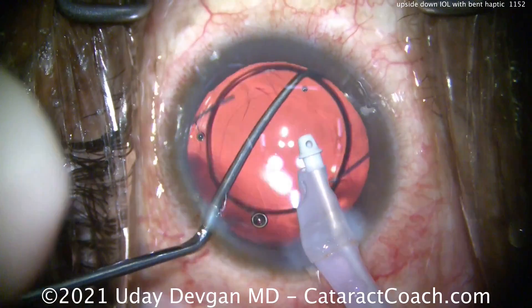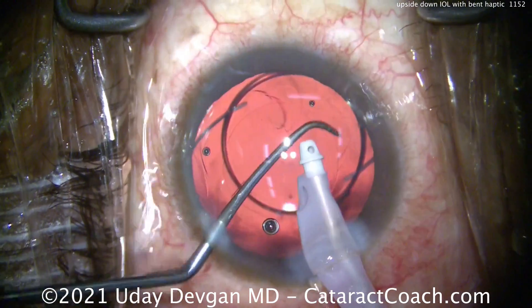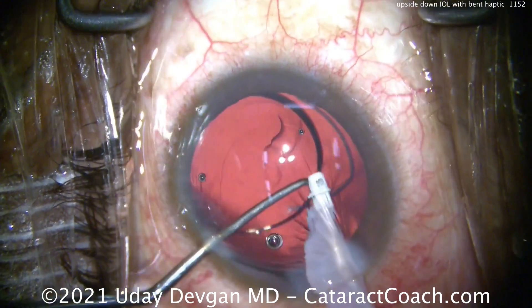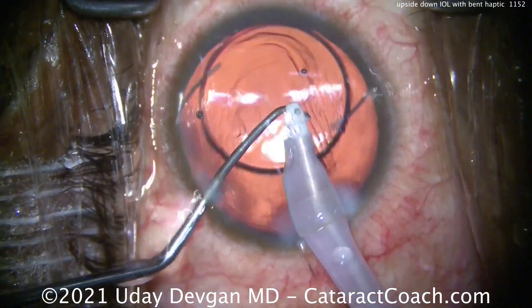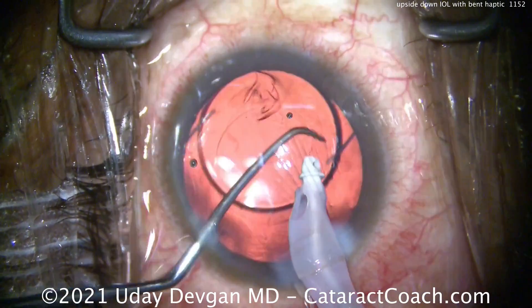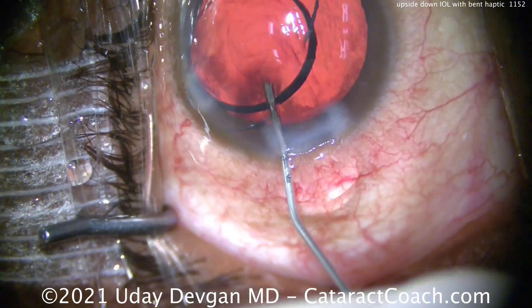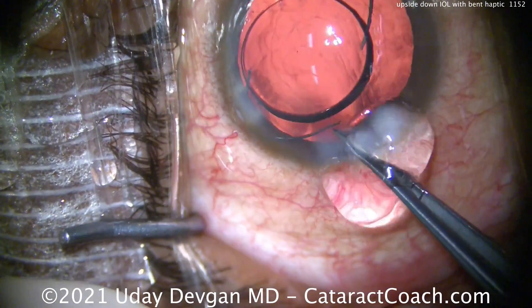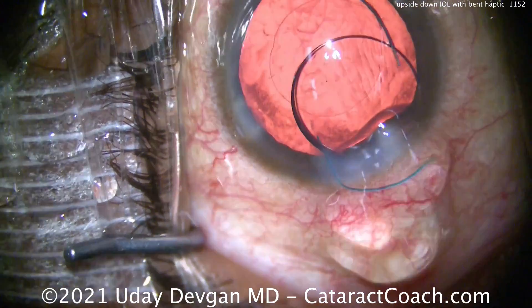We put the lens in the capsular bag and it's just not going to center well. It's an unusual lens — a plus 2 diopter lens. What if you don't have a backup? You can't leave it in there like this. You could optic capture it.